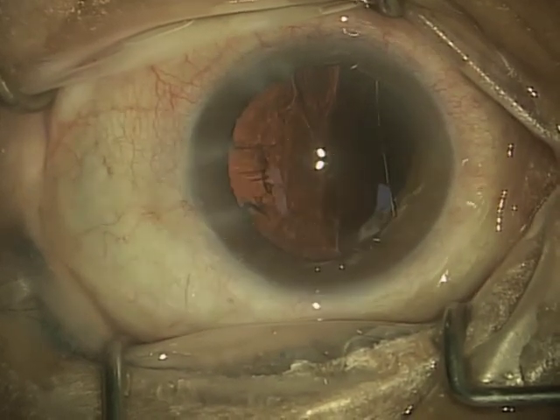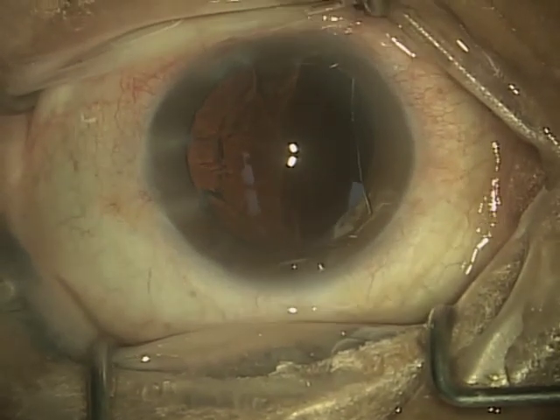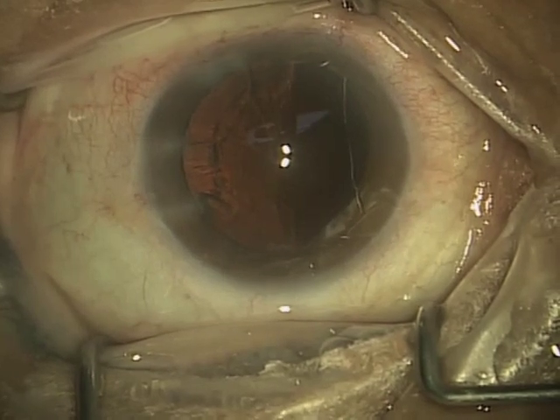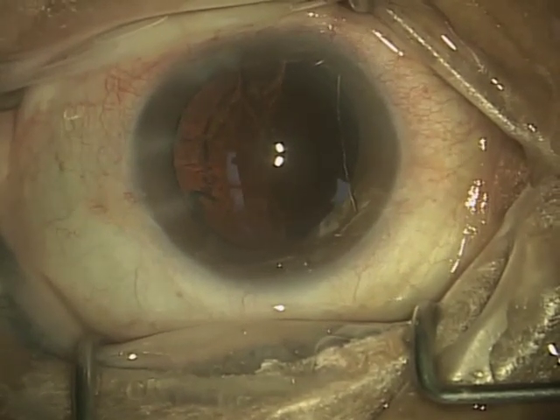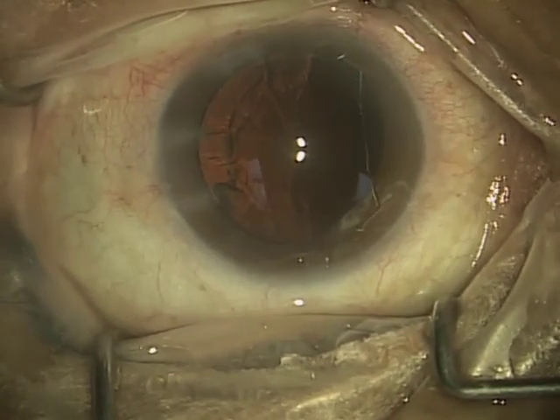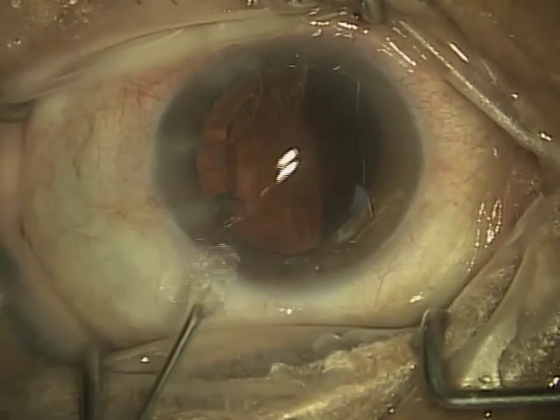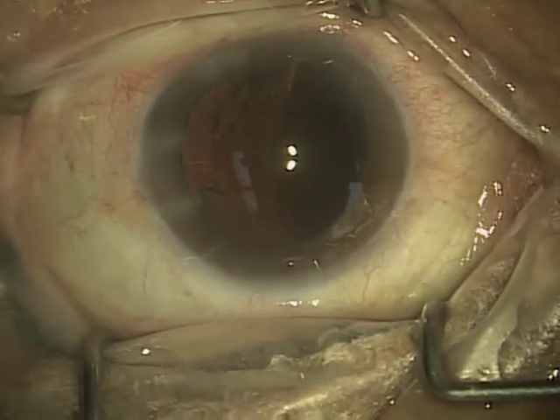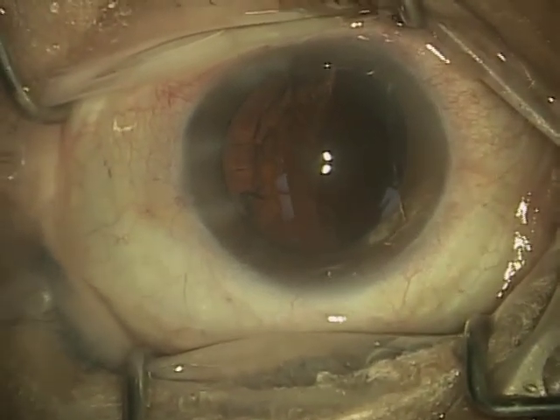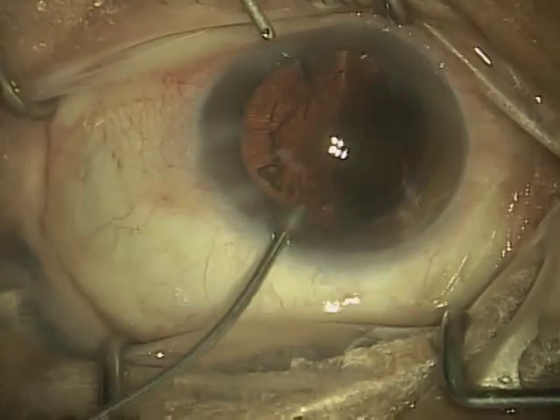Now, you notice it's pretty clear, except over on the side you see there's a little bit of haze. That's what we call the cortical material, and in a second you'll see that I start removing that with two instruments. I use what's called a bimanual irrigation and aspiration set. Not everybody uses bimanual, and later you'll see what is more typically used, which is called coaxial, but I find that the bimanual gives me a lot better control over the removal of this cortical material.